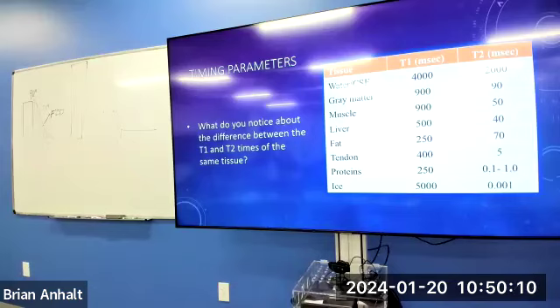How long are scans typically? Is it like 30 minutes to an hour? Nowadays, one pulse sequence, like an axial T2 weighted image, is probably around 3 minutes. It can be less or more, but I would say average is probably 2.5 to 3 minutes. And then every single protocol has at least 5 different sequence contrasts.